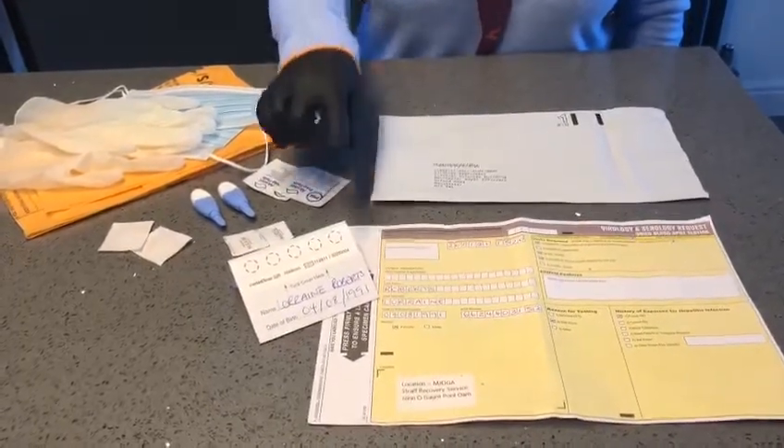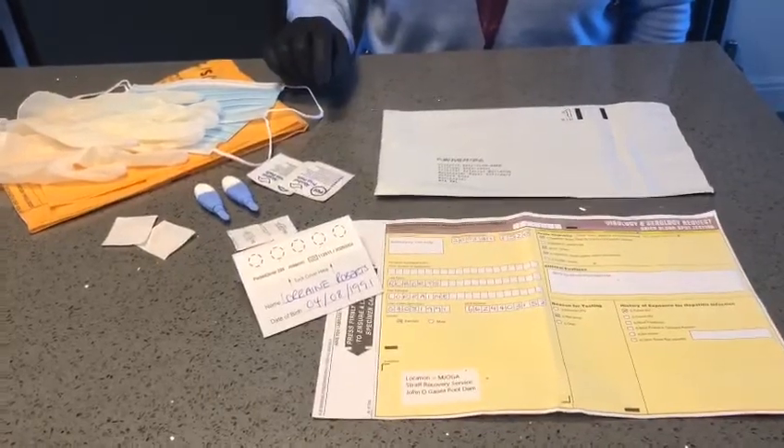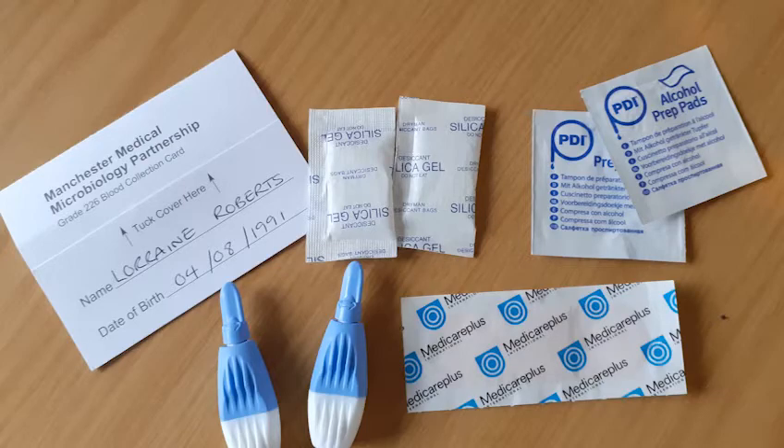You have a sample card, you have two alcohol wipes, a silica gel sachet, two lancets and two plasters.